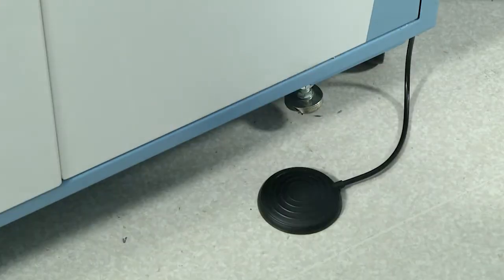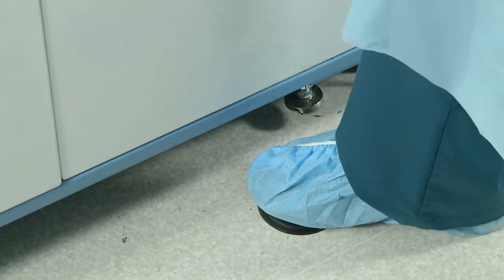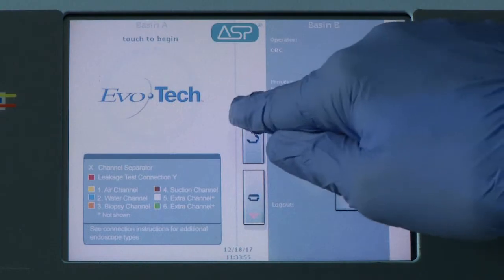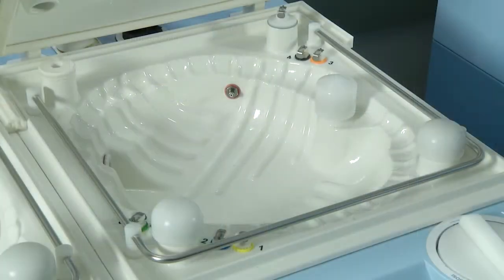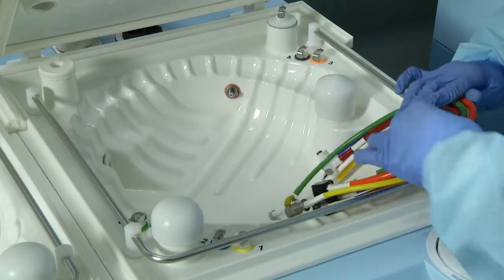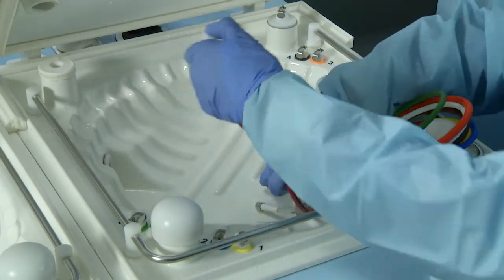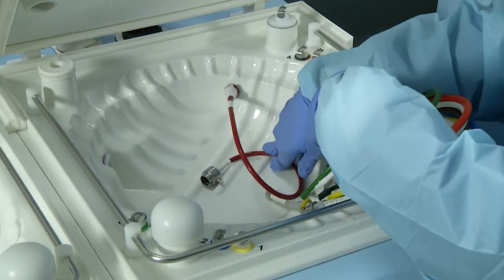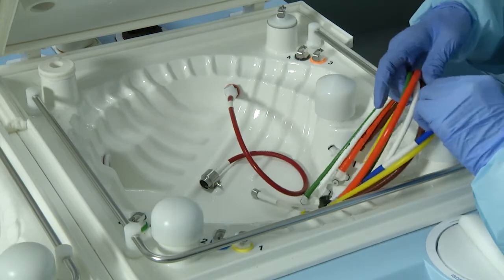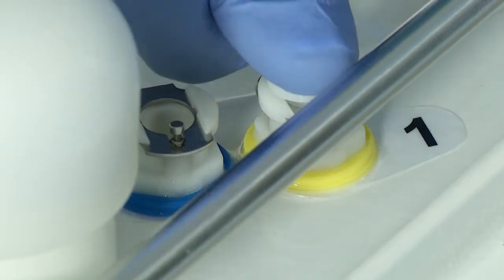To open the EVOTECH lid, step on the foot pedal of the side you wish to use for 1 second, or use the touch screen button with clean hands or gloves. To connect your scope to the basin, snap the color-coded connectors into the corresponding color-coded ports on the EVOTECH basin. Confirm that you hear and feel a click to verify the connectors are fully snapped properly into the basin.